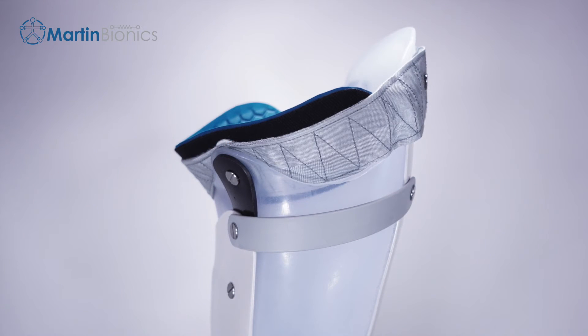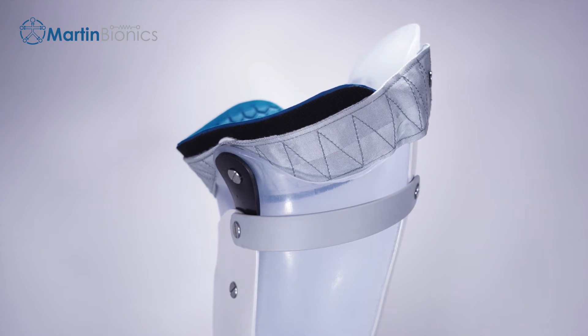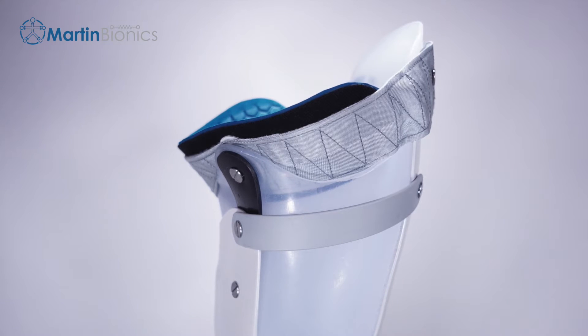The Swing Brim can be purchased independently from the full Socketless Socket Kit and easily integrates within most any conventional socket design by any clinical prosthetics provider.